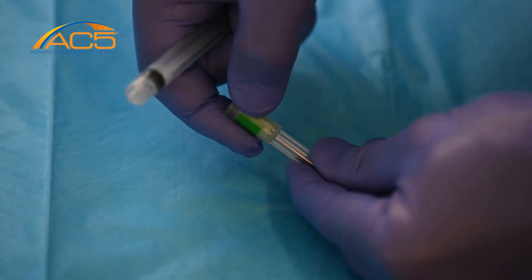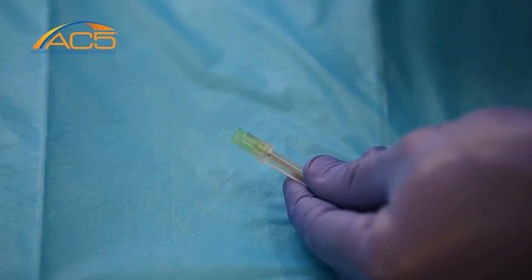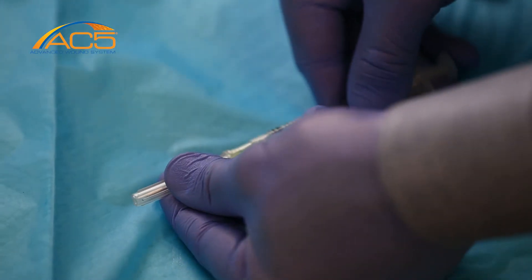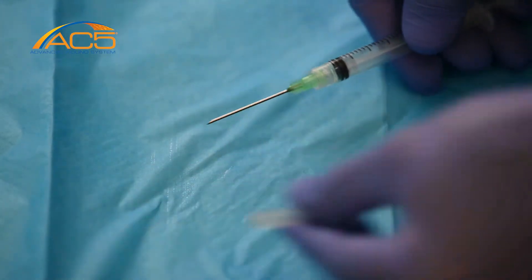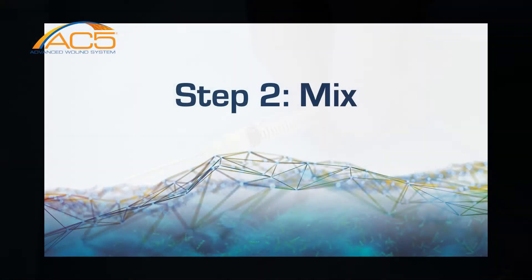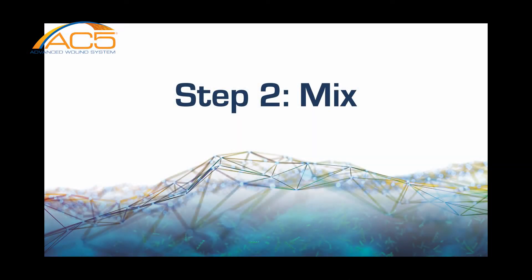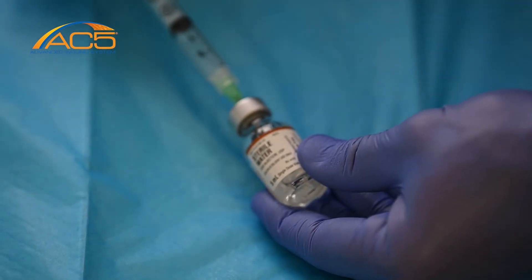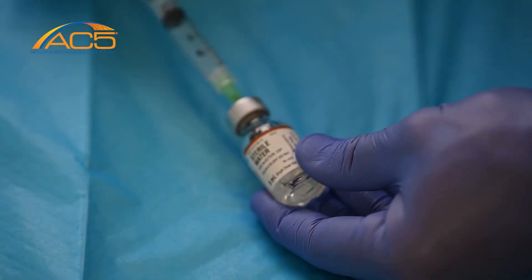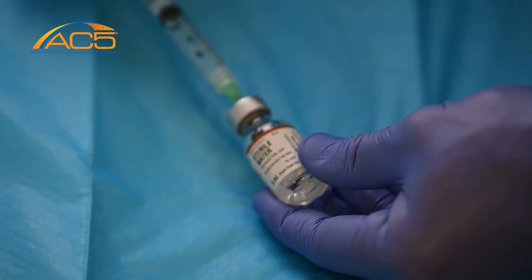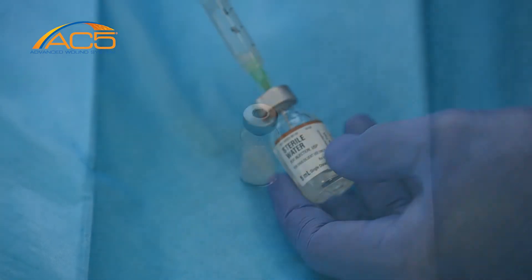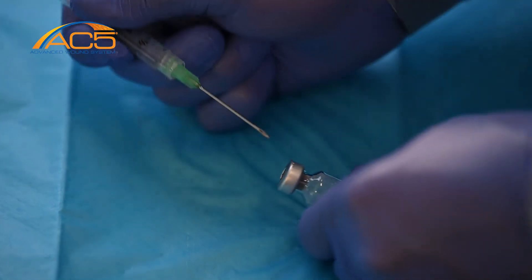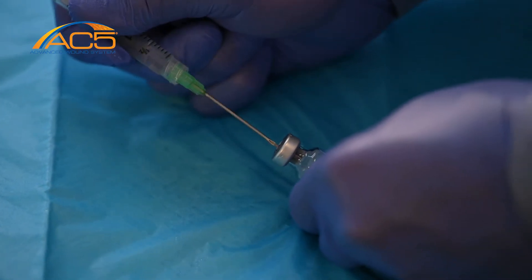Attach the 18-gauge needle to the 3-milliliter syringe. Draw 1.5 milliliters of sterile water into the syringe and transfer it into the AC5 peptide vial.